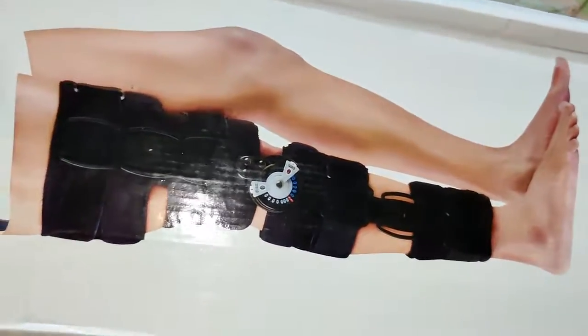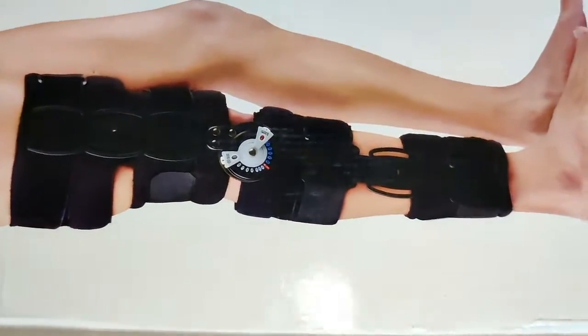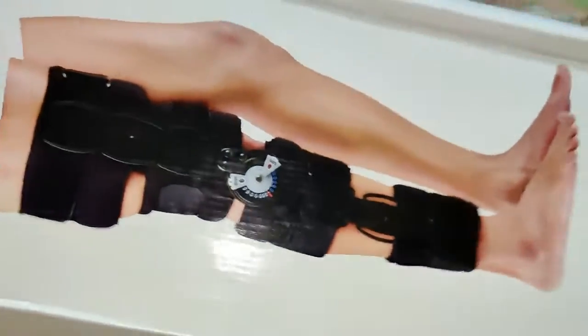Hi friends, coming straight into the video. Those who have gone through ACL surgery must have to wear the ACL brace. The product looks like this — the brand I purchased is Dyna, and the product looks like this.